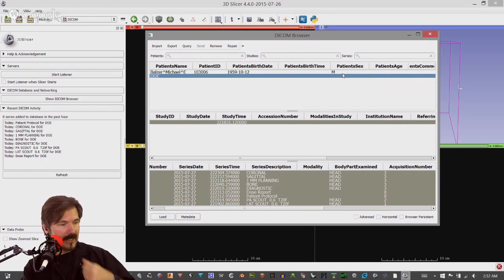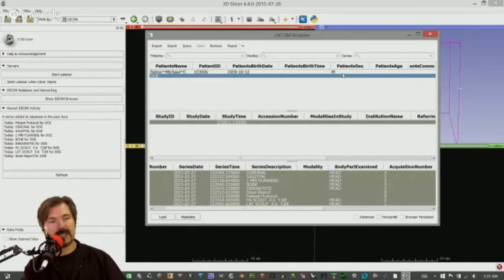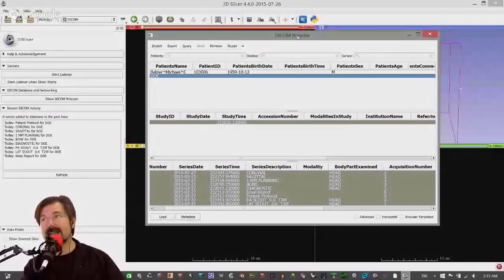And another cool thing about the DICOM, because it is essentially mainly grayscale images in either 24-bit or 32-bit, and essentially a database, is a lot of metadata that's associated with it. And there are quite a few two-dimensional DICOM browsers out there that are free. And there are even some online versions now, which I've looked at a couple. I think Image 32 is one of them, that allows you to upload your information and have other medical professionals review it with you. So I think we're heading into the day where snail mail won't be needed anymore. I did ask them if they'll provide 3D functionality. That's in the future. So we're kind of ahead of the game still here.